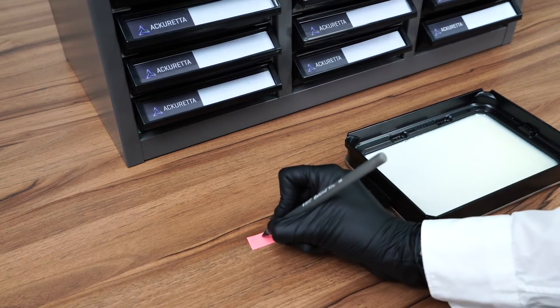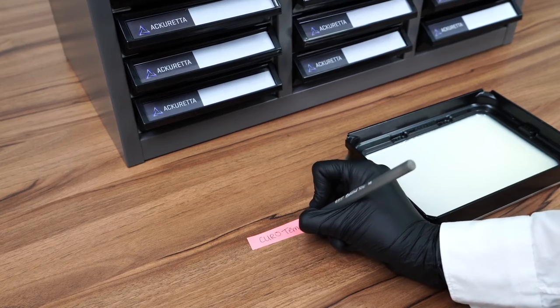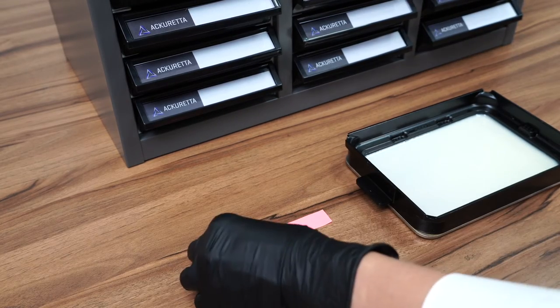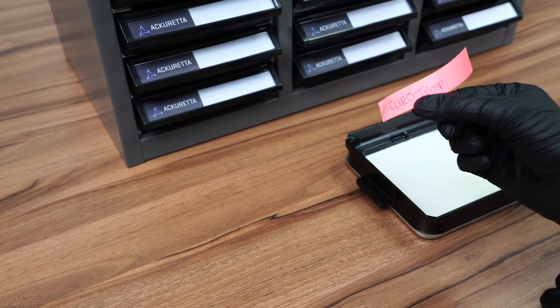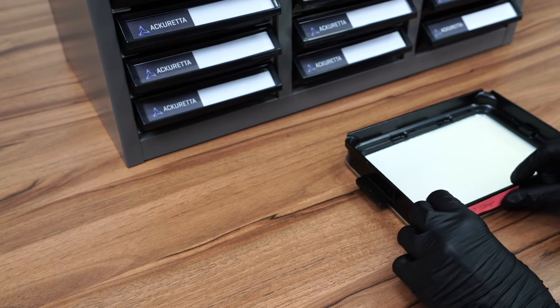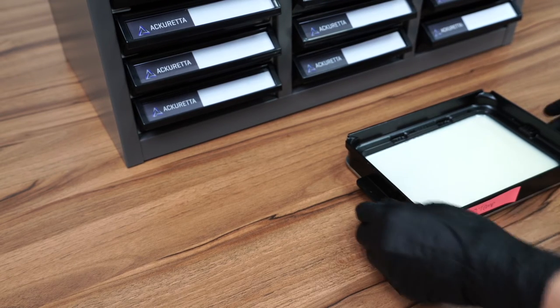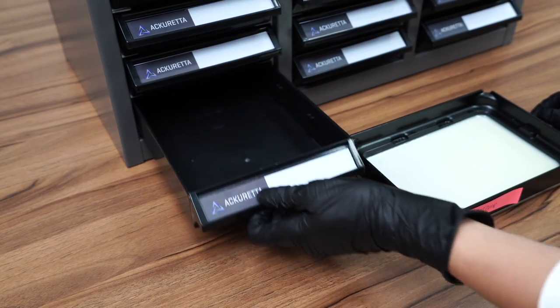All you need to do is write down what resin you are using, ideally on a sticky note. So I have CuroTemp here. Then I'm going to place it on the side of my vat and then take my vat and place it inside of the drawers of my organizer.